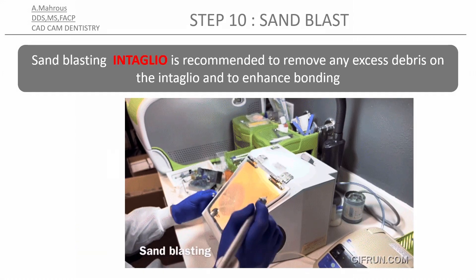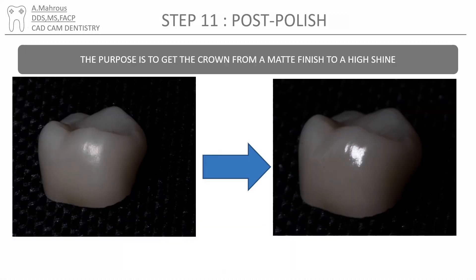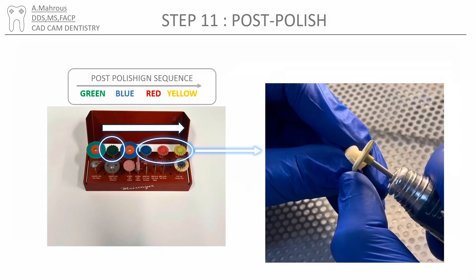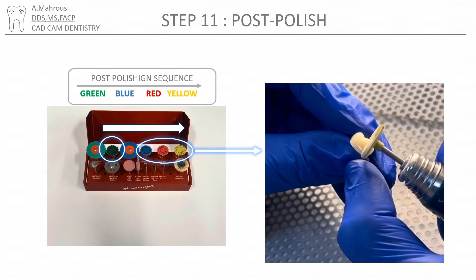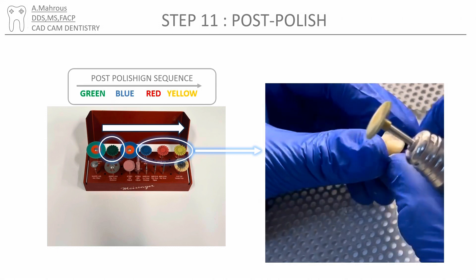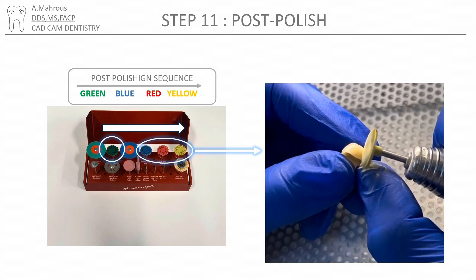Once cool, sandblast the intaglio to remove any remaining debris and enhance bonding. The next stage is post-polishing, which takes the crown from a matte finish to a high shine. You'll use the different polishers in this order, although sometimes only the last two are recommended to bring it to a high shine. While using the last polisher, you can go over all the surfaces including the interproximals and the margins.